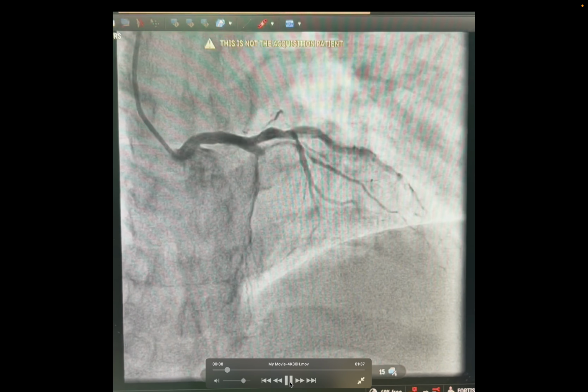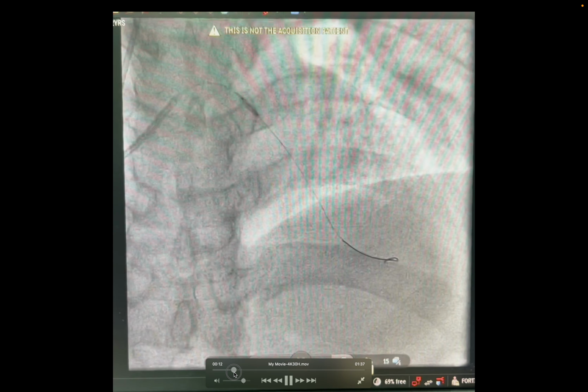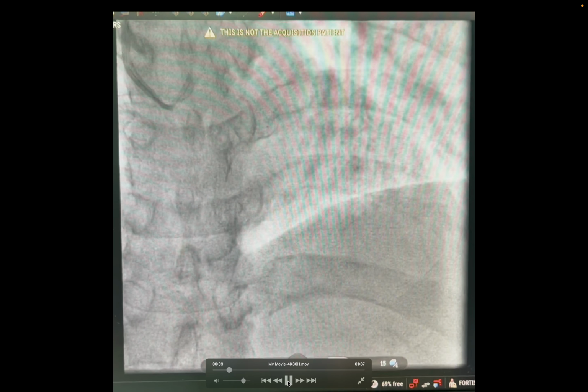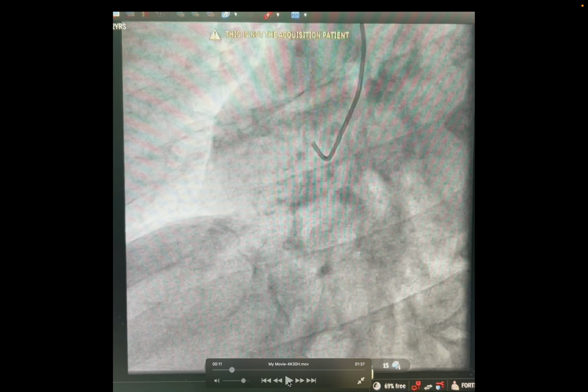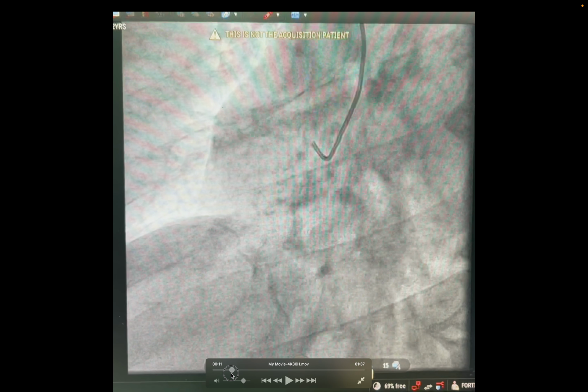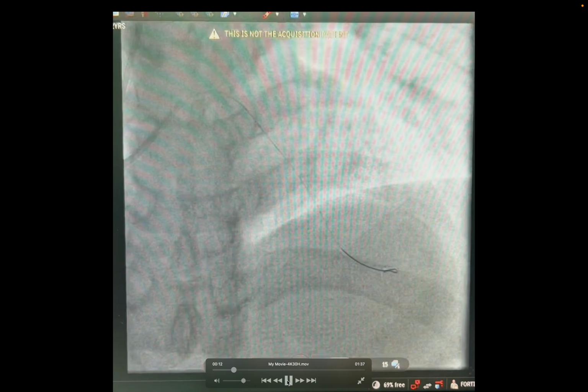So I opened this artery, anticipating that there would be only one blockage, but as you can see, the right side is also blocked. I'll just take it back. The right side also shows 100% block, and there is a lot of clot over there, and it has not yet opened. It should come like this. Okay, so this is a very tedious job for me, and the patient has been arrested, put on a ventilator, and I have to open both of these arteries.